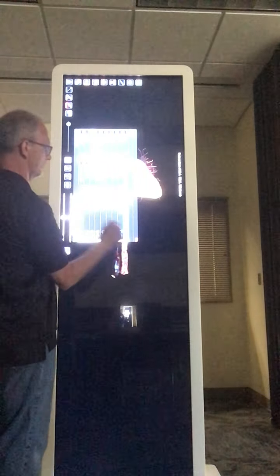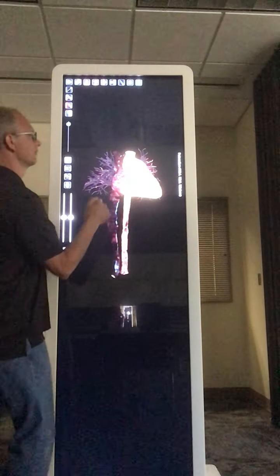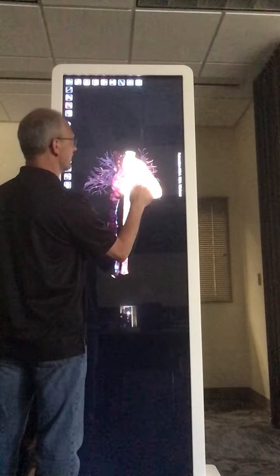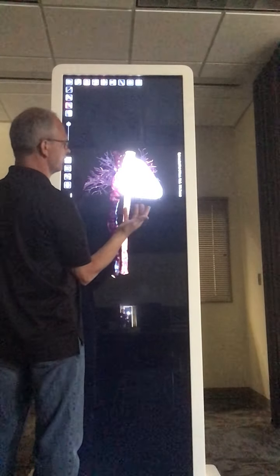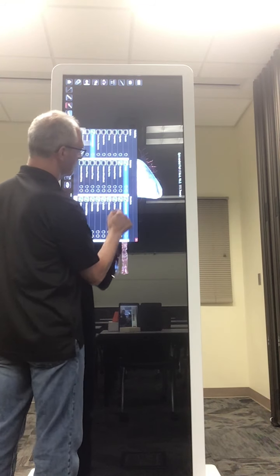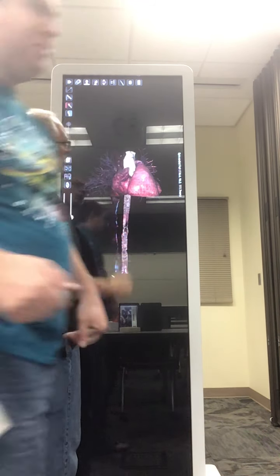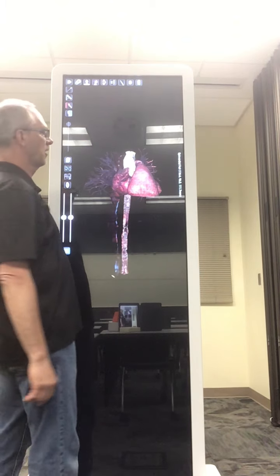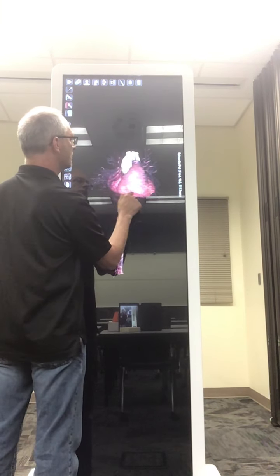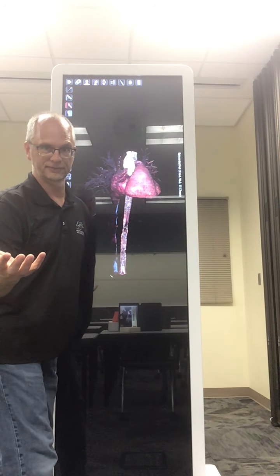pericardium. So now you can see a little bit more. We took out the pericardial sac. You see a little bit more what this looks like. It's got fat on it, epicardial fat. There we go. Does that help? The heart's pretty much white, so we don't need the lights off anymore. It's much easier to see. And so now I've removed the epicardial fat, and now you can see a little bit more below that, right? And all of our hearts have fat on them.